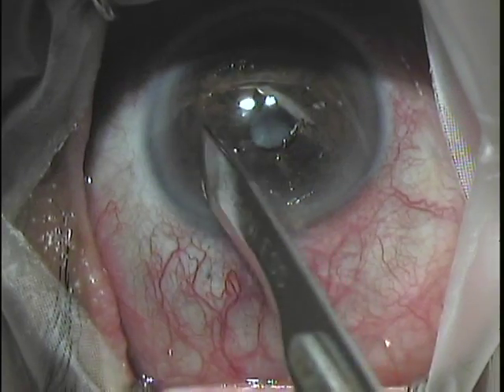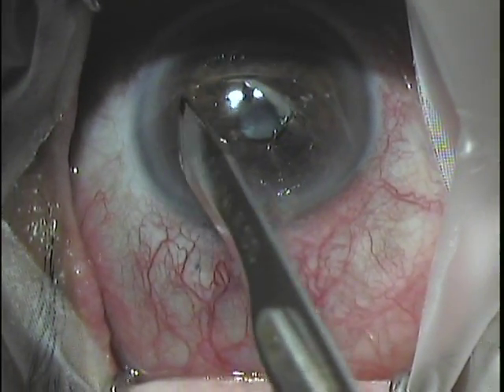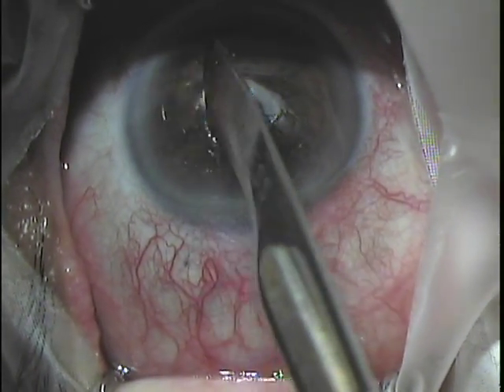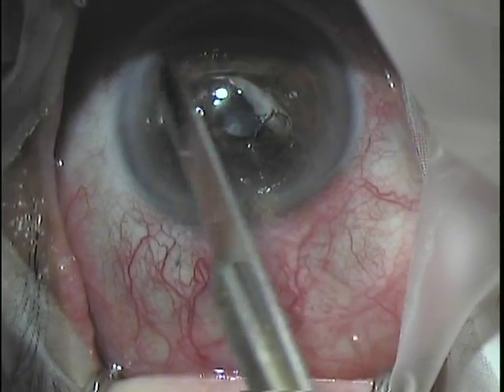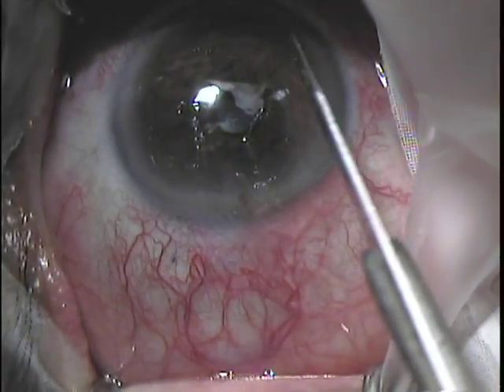This is a patient who had a non-healing corneal epithelial defect caused by prior exposure to mitomycin for treatment of an ocular melanoma. A bandage contact lens had been used for a number of weeks.